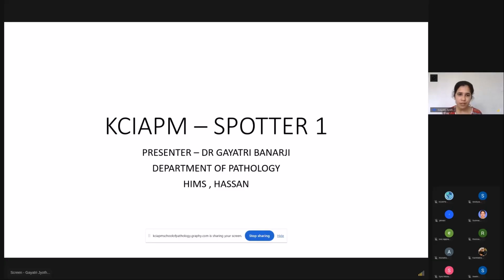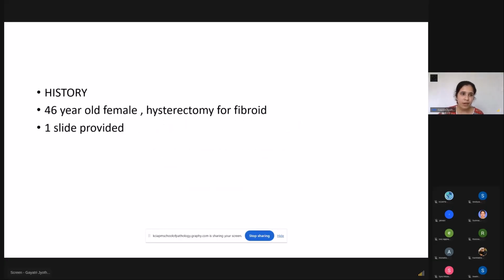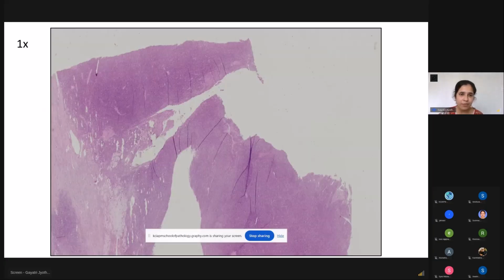Good morning to all. I am Dr. Gayatri Banerjee from the Pathology Department, Hassan Institute of Medical Sciences. I was allotted as spotter number 1. The history given was a 46-year-old female with hysterectomy done for fibroid, and one slide was provided. This was the slide we received.